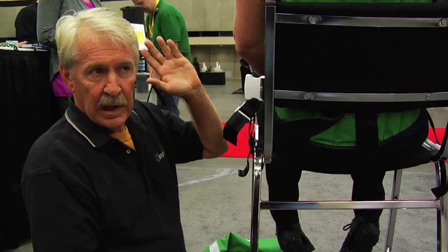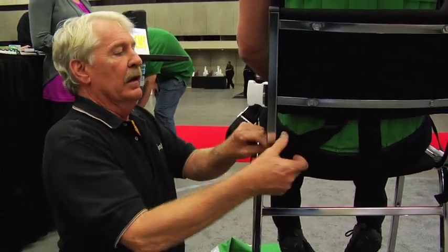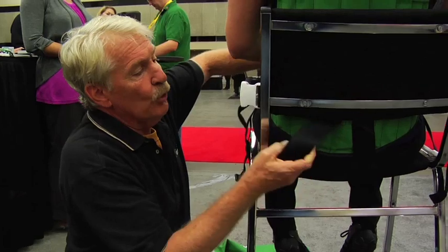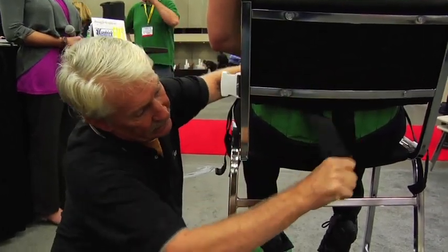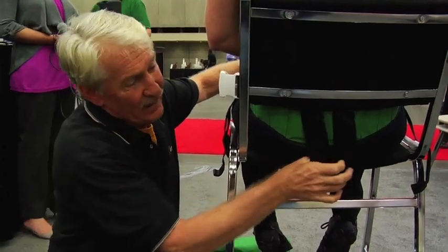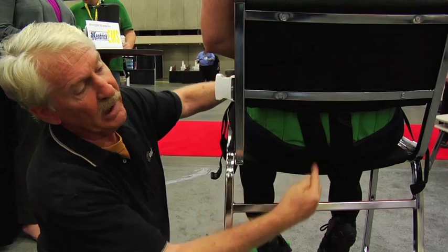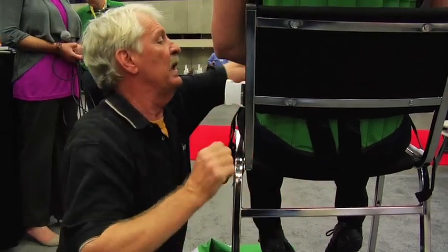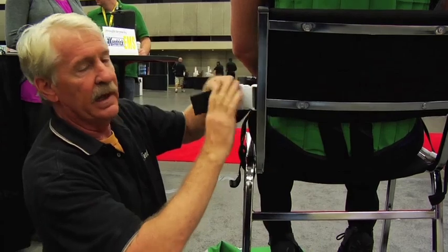Treat the training as though you were in the field — you're actually working on a patient. You work the strap, keep sliding it until you have your finger in the crack between the butt cheeks, you've got your thumb in there, and you're straight up the middle. Then the strap comes back and attaches.